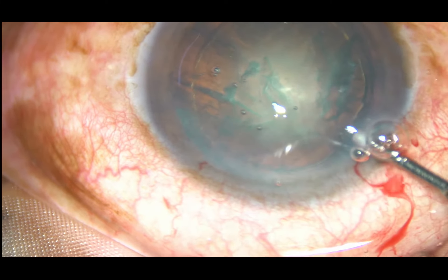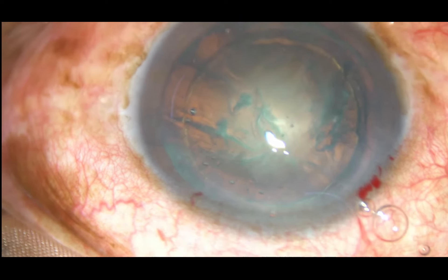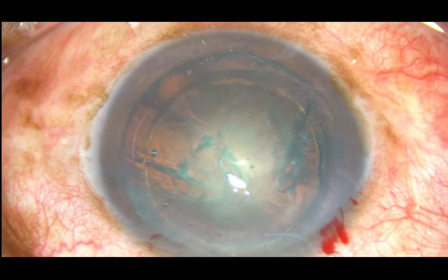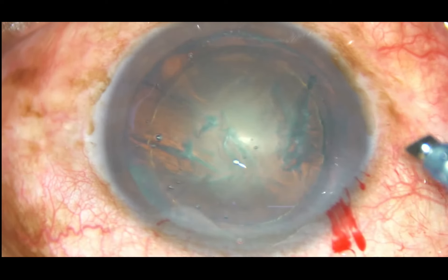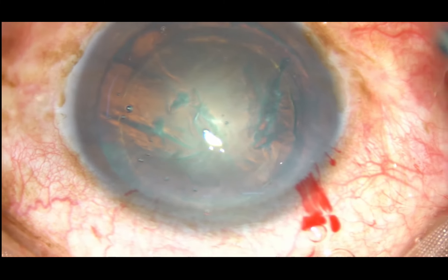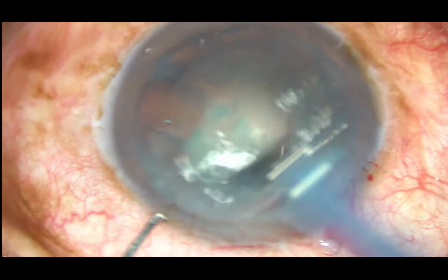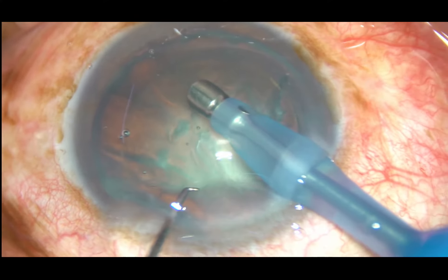For direct chop, what the beginner surgeon can do is, just in front of the main incision, make a crater — a triangular crater with the apex just in front of the main incision and the base at the center of the nucleus.